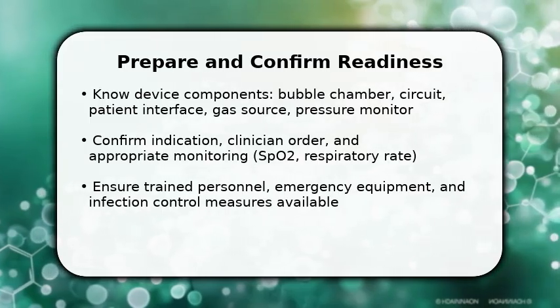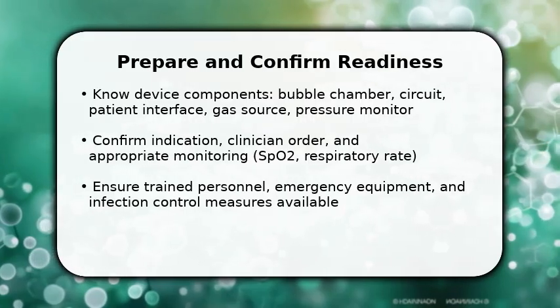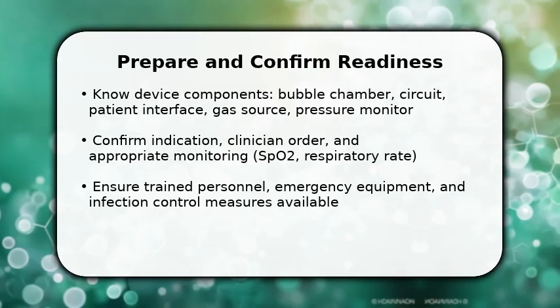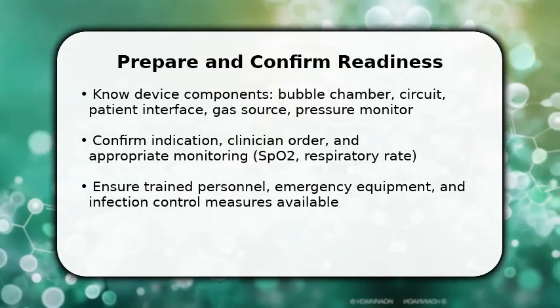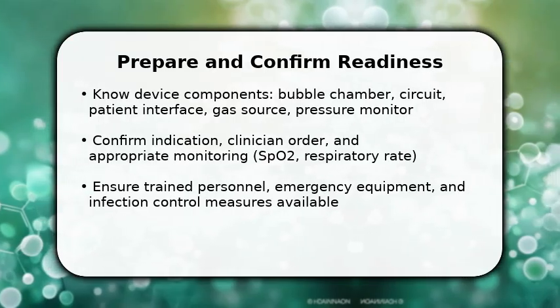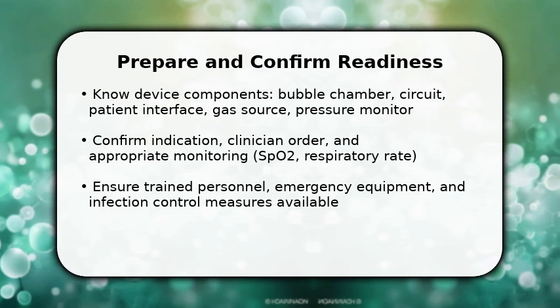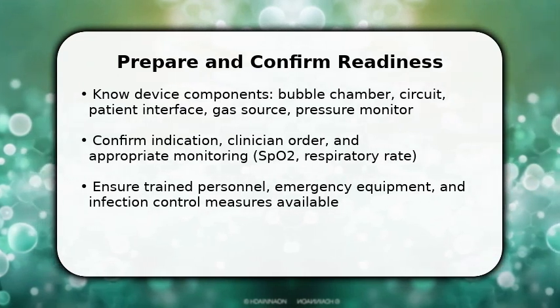Once you confirm the indication and monitoring, make sure you have a trained clinician available and emergency backup. You need proper infection control and approved consumables. Understanding these prerequisites prevents delays and unsafe attempts, so prioritize supervision and institutional policy before any hands-on work.